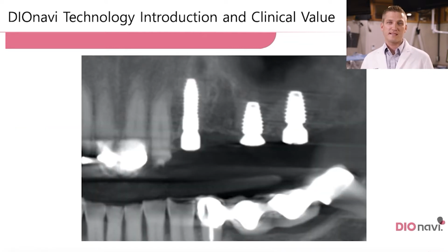This is a really cool case I did just a couple of weeks ago. What I love with this slide here is it really highlights, in essence, what the DIOnavi system does for me, for my practice, and my patients. This patient came in under 15 minutes. All of those implants went in with the guide, with surgical precision. The patient left thinking, have we even started?